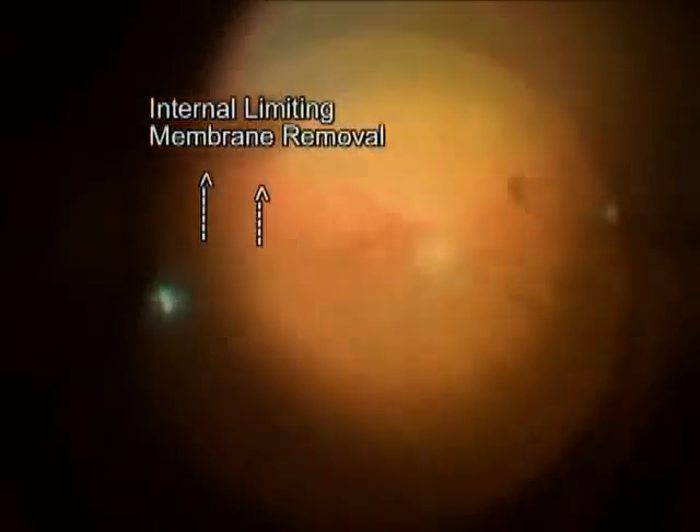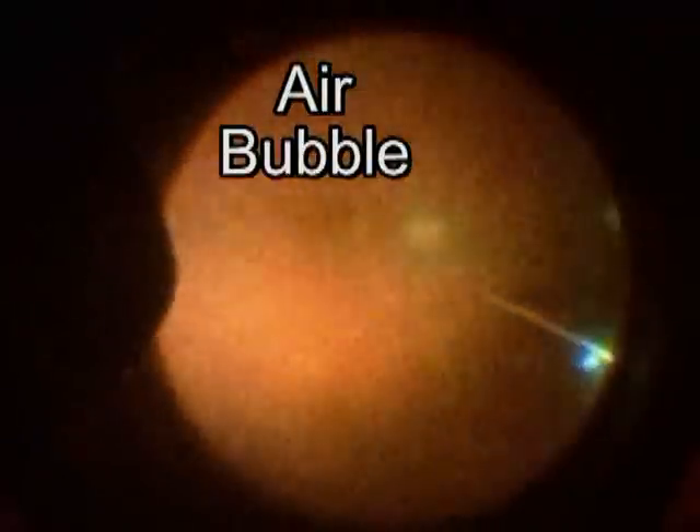Here you see much of the membrane being removed temporally. We used to stain the membranes with indocyanine green dye but currently with these new instruments it's not necessary. The next step of the procedure involves filling the eye with an air bubble. You just saw the air bubble moving in from the top left of the picture. The shiny reflection you're seeing is the interface of the air bubble and the intraocular fluids. The instrument on the right is a soft-tip cannula used to remove fluid from the eye, while the infusion is used to fill the eye with air. Here the last little bit of fluid is being removed from the eye.